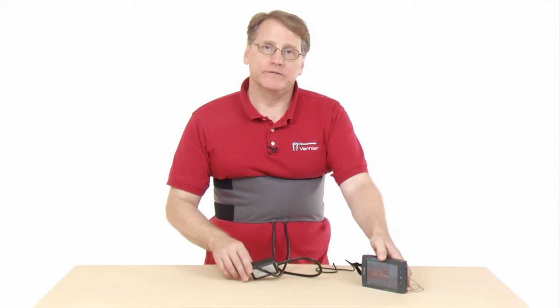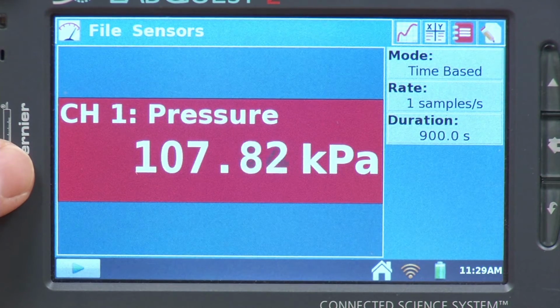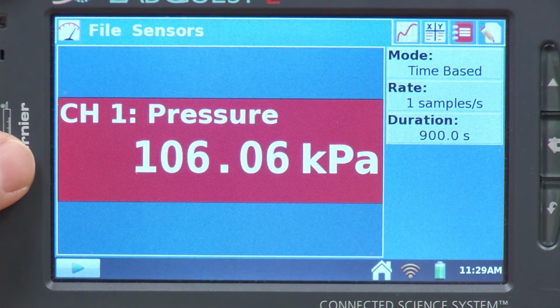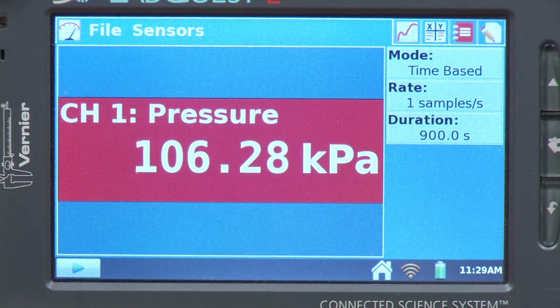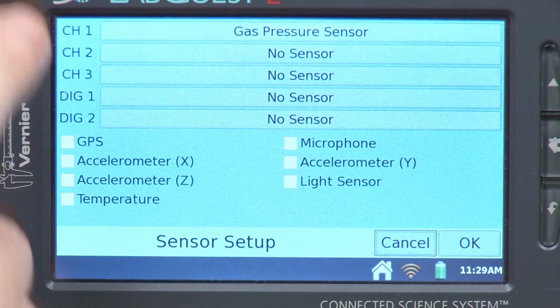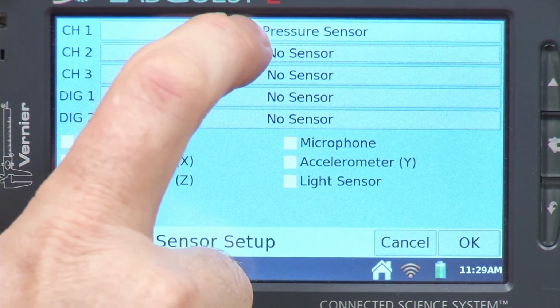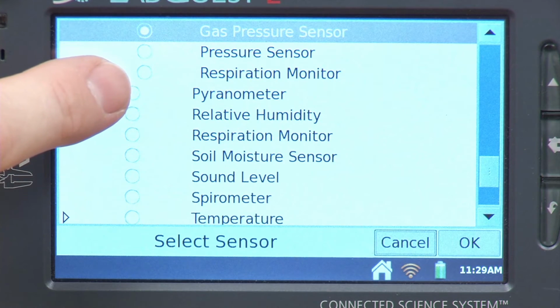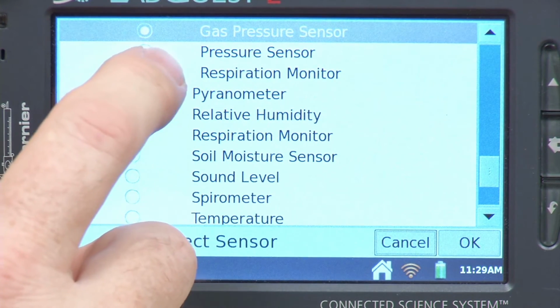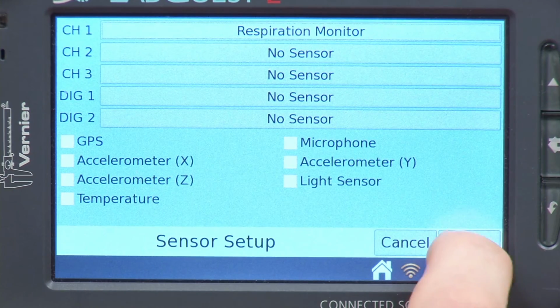So now that I have my belt set where it needs to be, I need to set up my device for the data collection. So right now, it's defaulting to seeing the gas pressure sensor, and I need to go in and tell it that I'm using the respiration monitor belt. What we see here is that the gas pressure sensor is in channel 1, but we actually want it to recognize that I'm using the respiration monitor belt. So to do this, I go up to where it says Sensors, and I do Sensor Setup, and it's going to create a list of the different channels, and we've got the gas pressure sensor in channel 1, and so I'll select channel 1. And down right there, kind of as a subset, it says respiration monitor. And so I will click there, I will say OK. And now I'm fine with that, so I'll go OK.